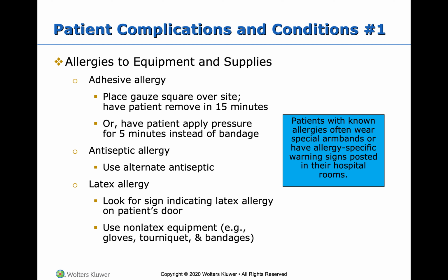I have had patients that, as soon as I walk into the room, say, I need Coban, I can't use tape. Perfect, thank you for letting me know. But if you're unsure, just ask, is paper tape okay? Or just use Coban. Although I've had one patient that has had an allergy to Coban and told me, I need tape. So I have both on my tray, and I assess the situation. Each draw I assess differently.